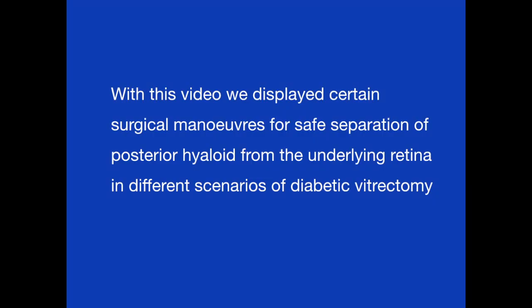With this video, we displayed certain surgical maneuvers for safe separation of the posterior hyaloid from the underlying retina in different scenarios of diabetic vitrectomy.